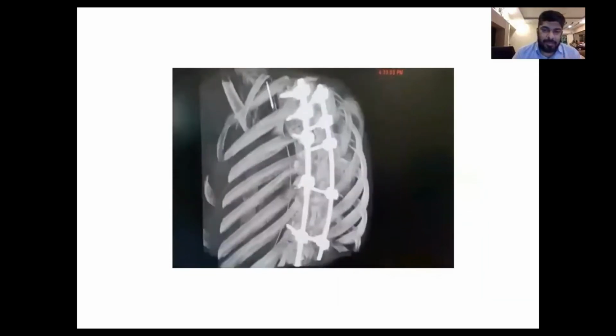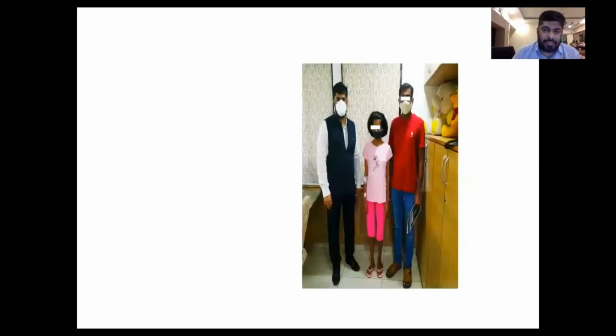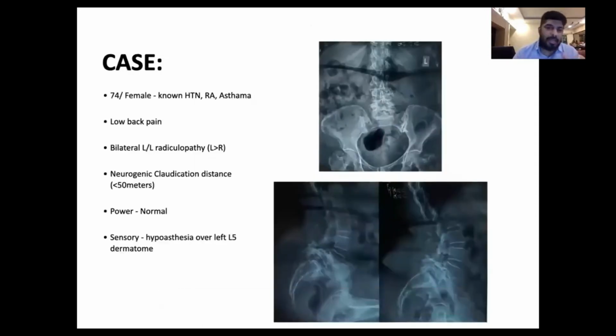And again, you really can understand your deformity very well. And kyphosis, yes, there is a big advantage of O-arm navigation. You can do the osteotomy, you can plan the osteotomy, and that's the big advantage. This is a young gentleman, 25-year-old, worsening deformity, IT engineer. We did a kyphosis correction. Big advantage of O-arm navigation in osteoporotic revisions and tumor, apart from deformity. These are the three-four very important forte.